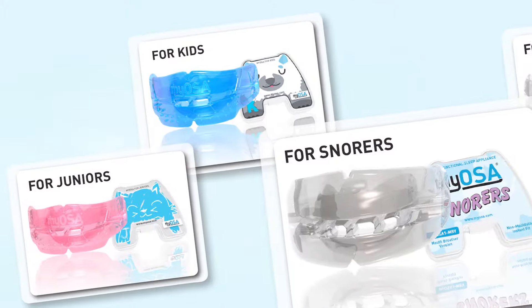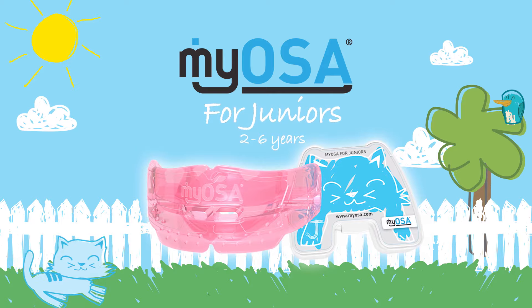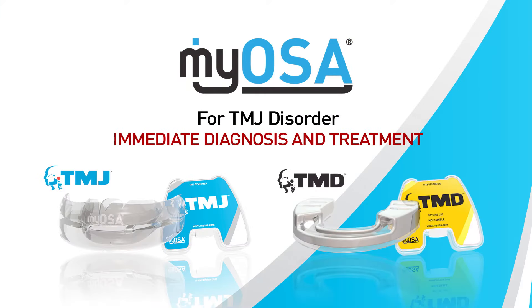The range includes appliances to suit sleep disorder breathing patients from as young as two years old through to adults, as well as specialty appliances targeted at TMJ disorder and bruxing.